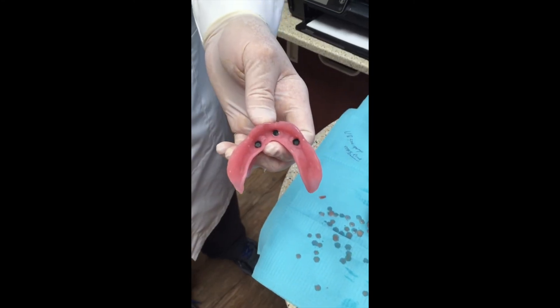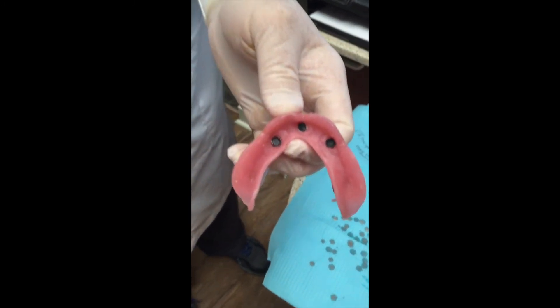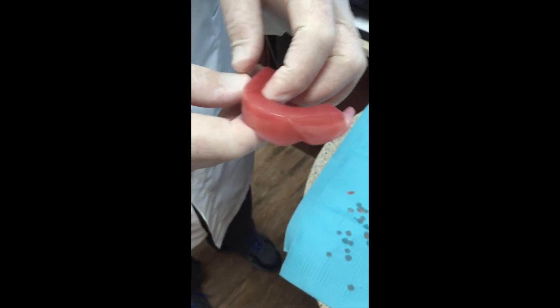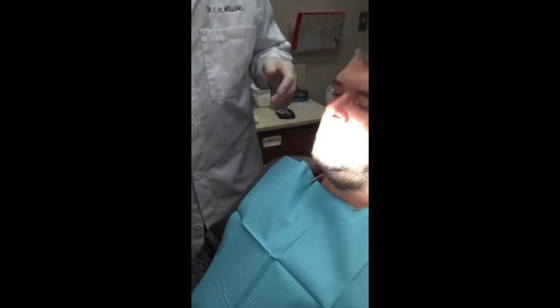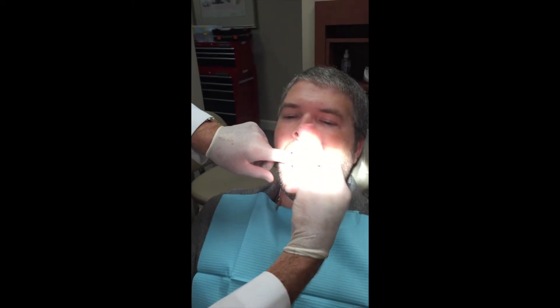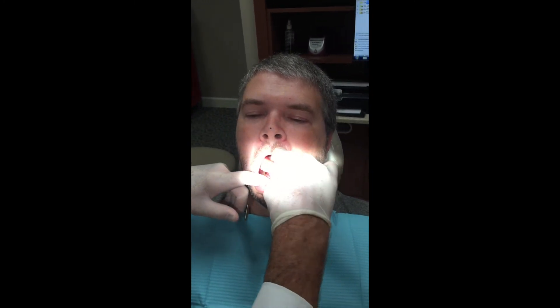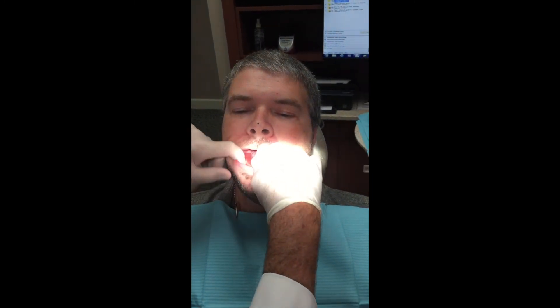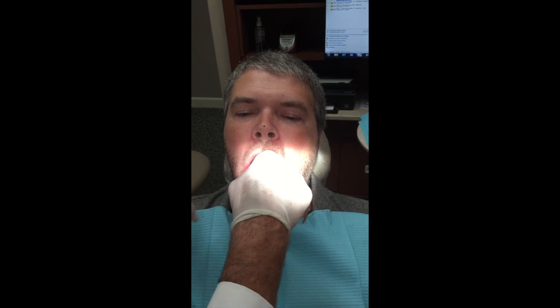You'll notice that we have the locators — the processing caps — embedded in a triad record base. I use hard wax rim, not soft base plate wax. This is hard wax. Now we're coming to the mouth. I like to use a rotating motion into the mouth, and then we're seating it over his locators, very gently pulling the lips out of the way with the tongue back. I'm going to put a little gentle pressure and we feel it snug in.